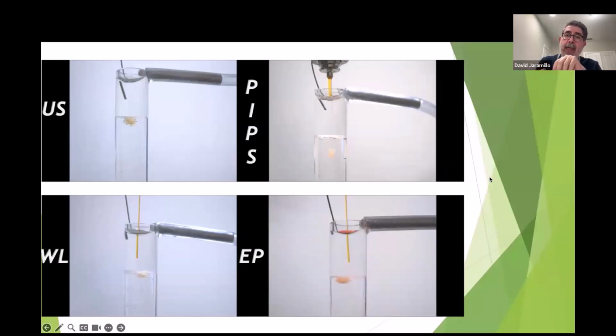But the PIPS technique keeps us in the pulp chamber. The efficacy of the technique will be on the absorption, how the laser is absorbed and how it produces this streaming. In this study that I was telling you about with Dr. Cox and Dr. DeVito and Dr. Peters and myself, we found activity from the tip of the PIPS 18 millimeters away from the tip. There was displacement with a good amount of speed and distance.